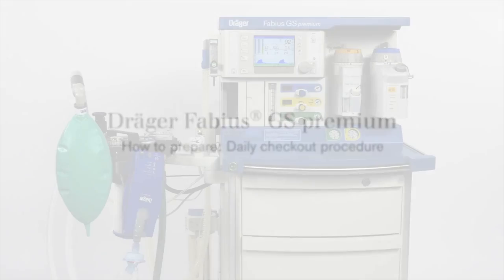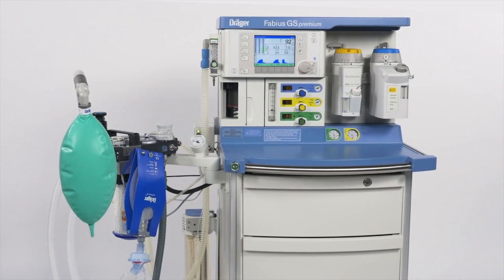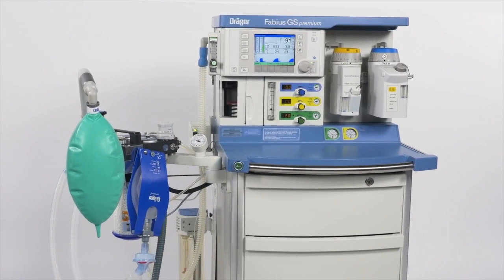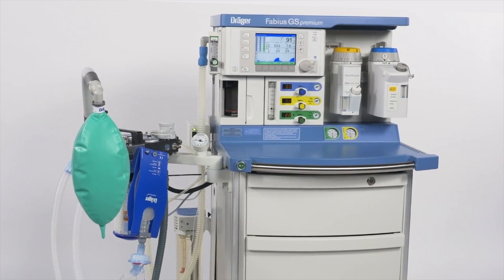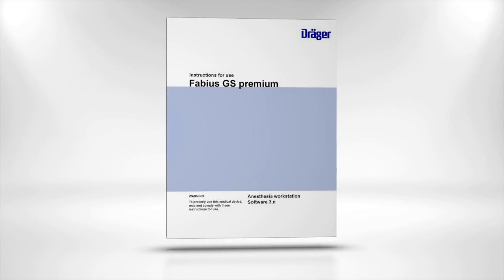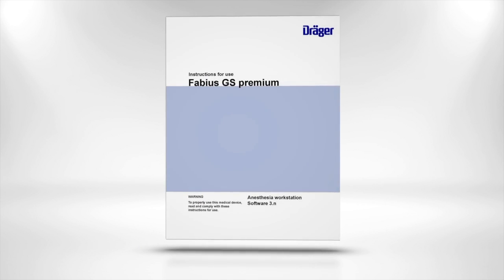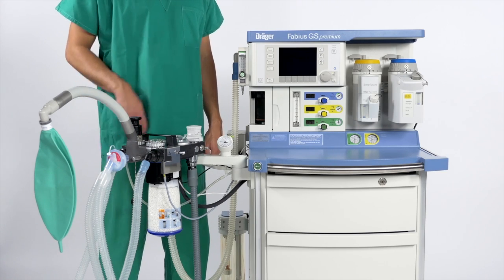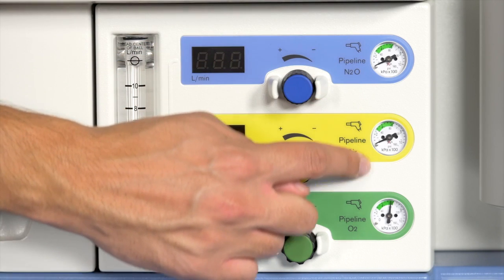The respiratory rate was set to maintain pH 7.30 and PaCO2 50 mm Hg, and positive end-expiratory pressure, PEEP, was set to maintain PaO2 70 mm Hg or SaO2 93% with FiO2 equal to 0.50. The spirometry module recorded peak inspiratory airway pressure, peak, plateau airway pressure, plat, mean airway pressure, mean, dynamic lung compliance, CDYN, and static lung compliance, STAT.